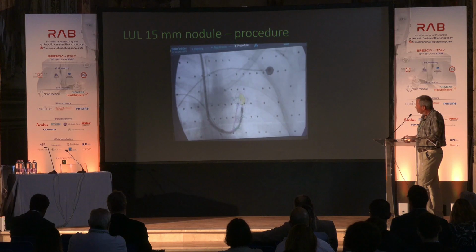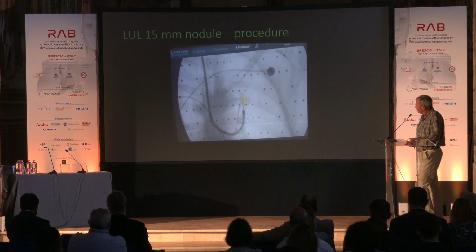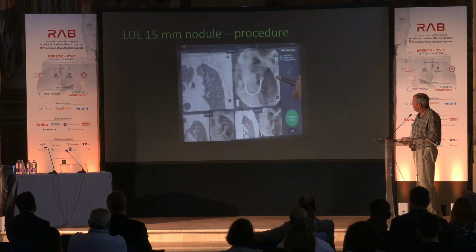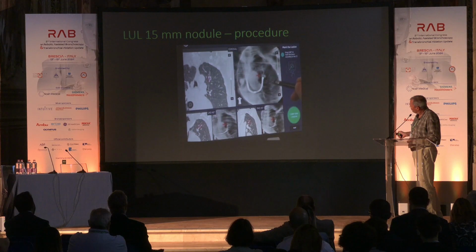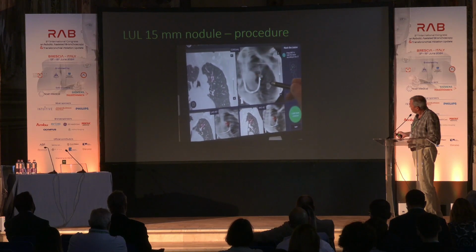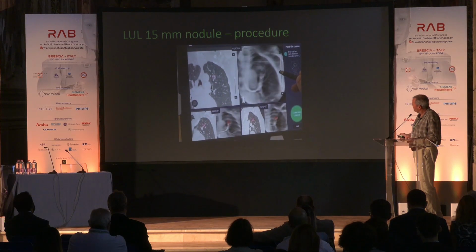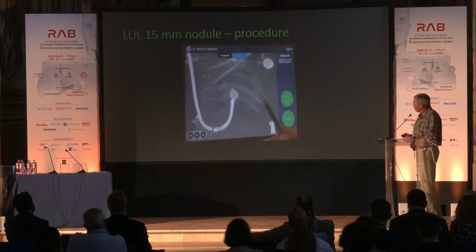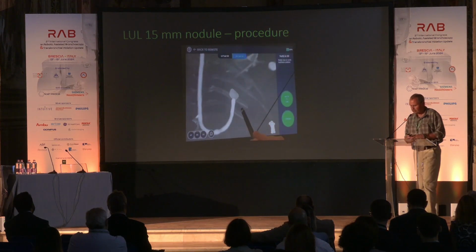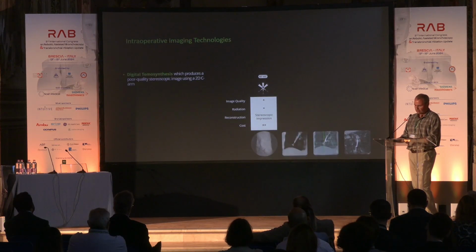This is a sampling. And this is very important. This is a tool-in-lesion. This is the scope in real time. This is the nodule, and you can see that your tool or your scope is exactly on that nodule. And if you want, you can even have a 3D reconstruction.